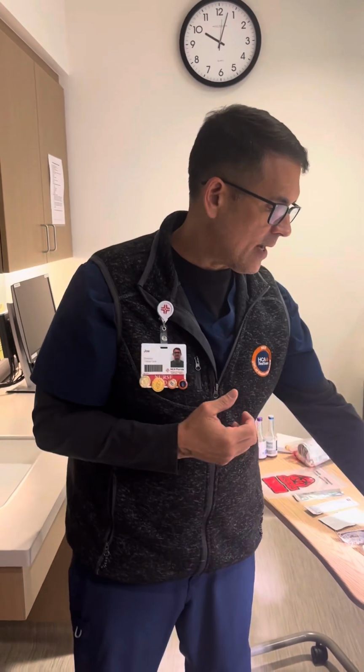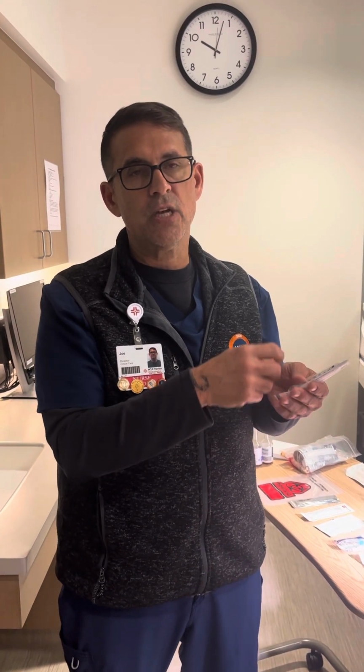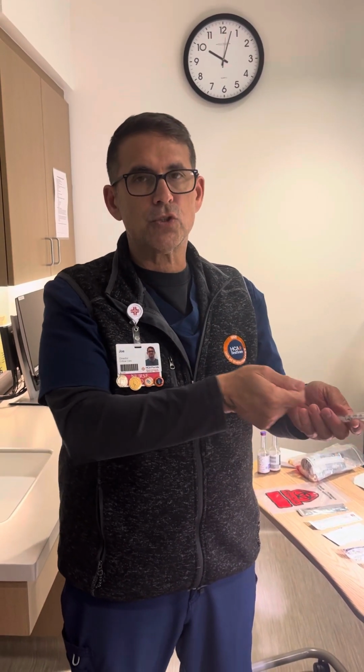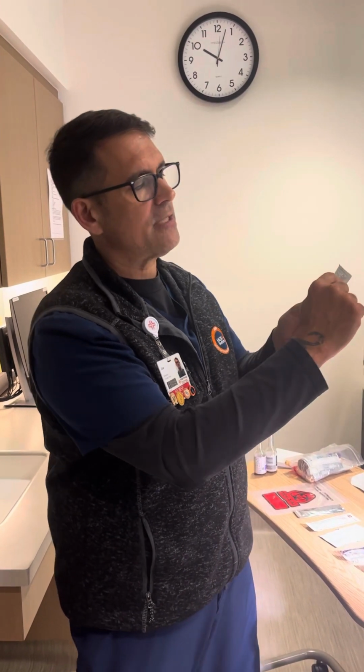The number one reason blood gets hemolyzed is that when you draw in a syringe, you create suction inside the syringe, and you're exploding those cells with the suction you create. So you should never draw back blood and create suction. When I say suction, I mean that little air pocket gets really big. If you do that, throw the sample away and start drawing again.